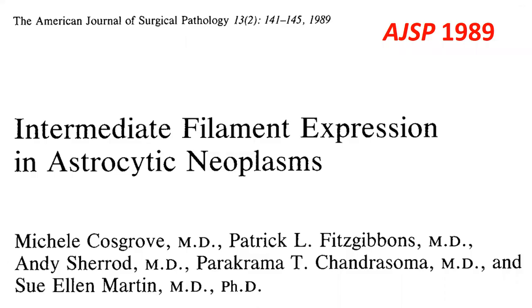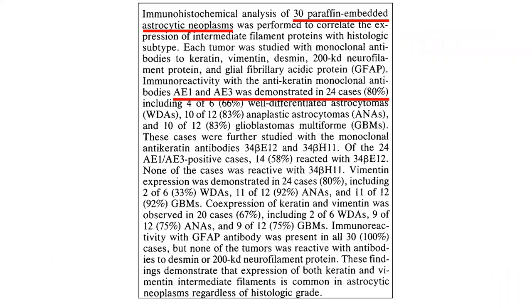American Journal of Surgical Pathology, 1989. Intermediate filament expression in astrocytic neoplasms, 30 astrocytomas. AE1 and AE3 was demonstrated in 80%.